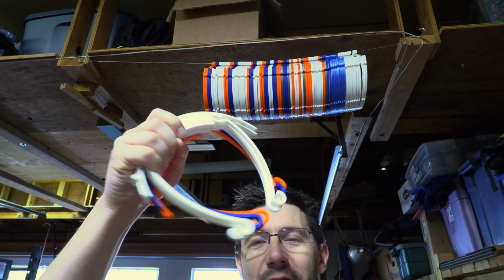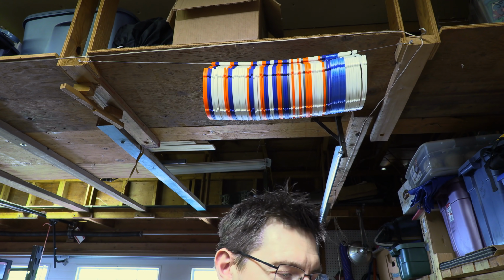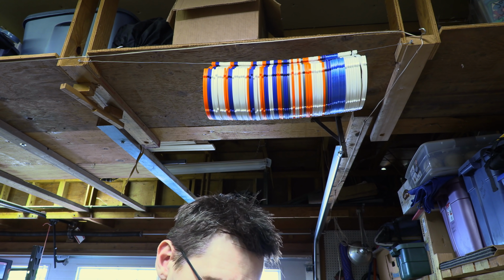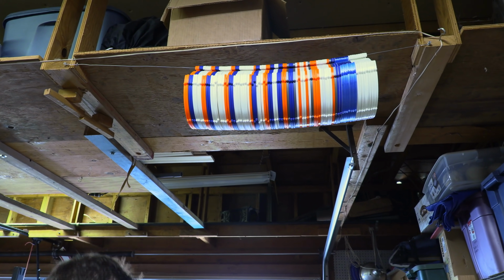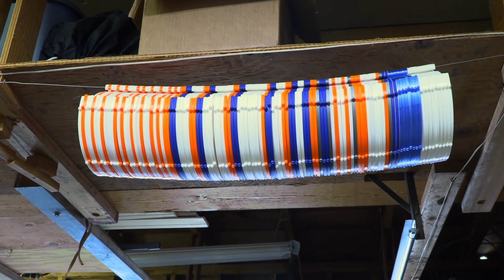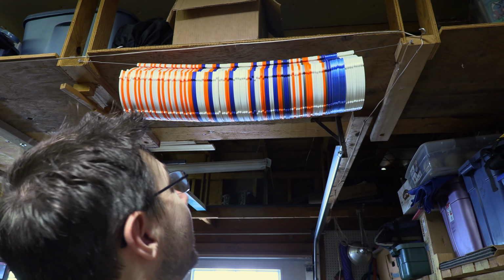So we've got our ones from down here in the garage, and we have all of our ones from upstairs. And the thing you're looking at now is this little wire that I've put across. The idea is that wire holds onto these and it makes it easy for me to grab them when I need to. So let's get these all up on the wire. They're all up there. That's fantastic. So now that I have the, that's better. We've got product over there.